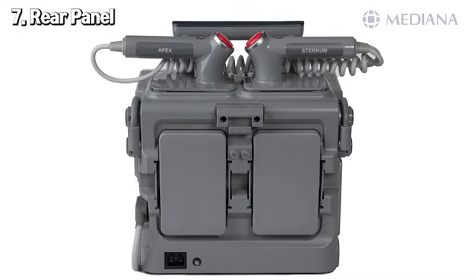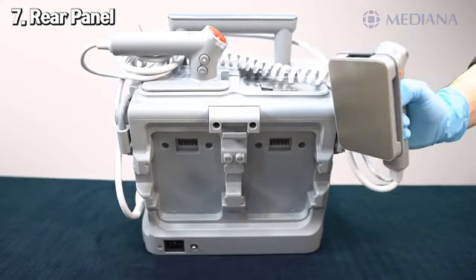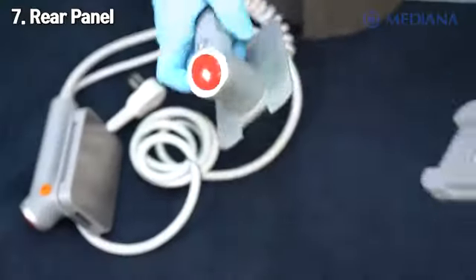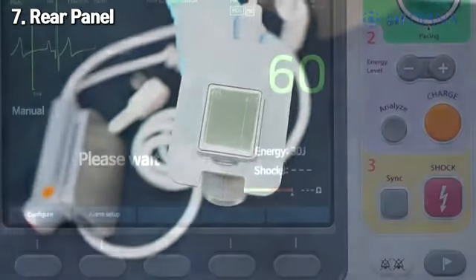If we look at the back side of the device, we have external paddles, dual batteries, and a DC power connector which connects to the external cradle for charging. The paddle is an assembled product intended for adult patients. Remove the plate of the paddle for adult, and there is the paddle for pediatric patients.